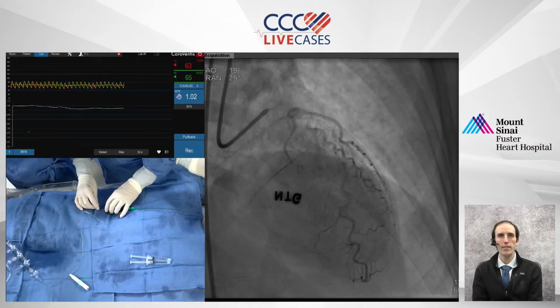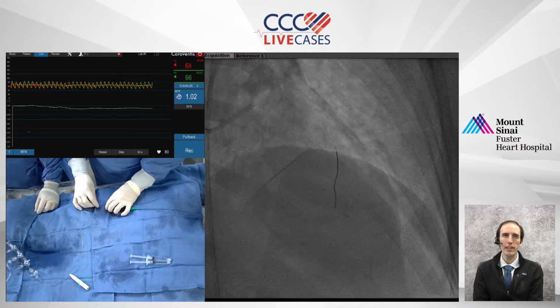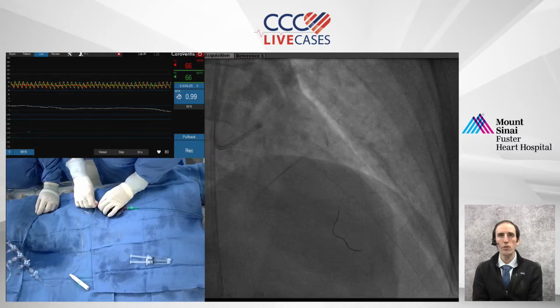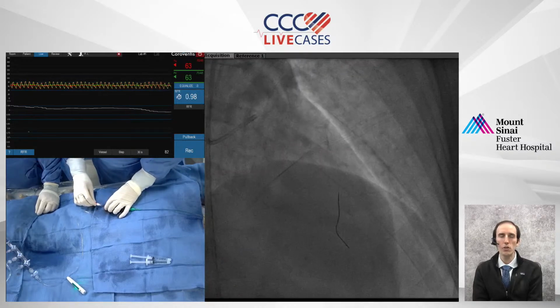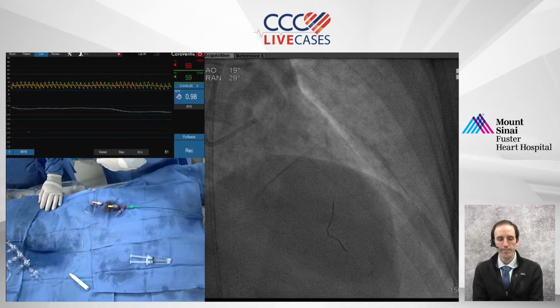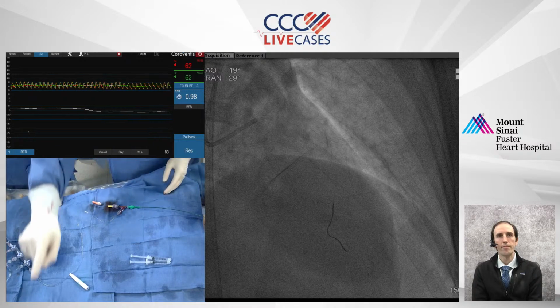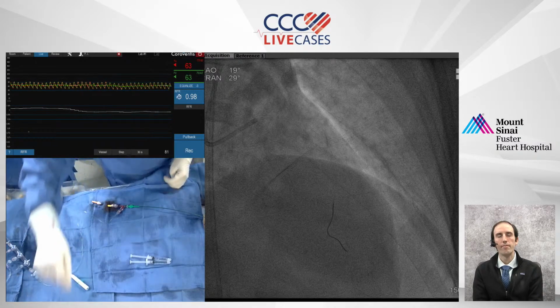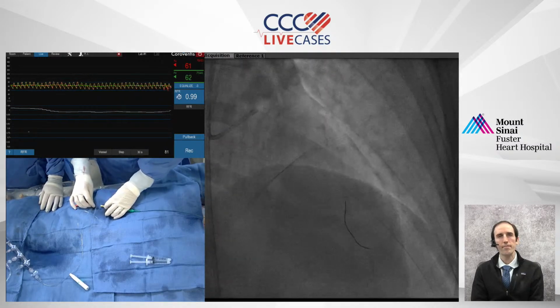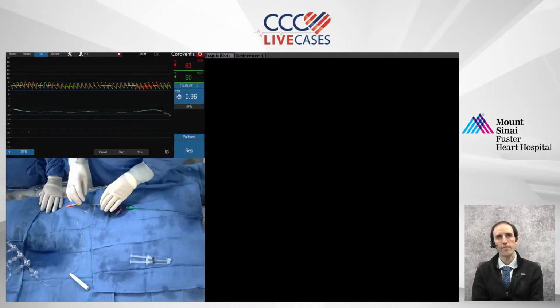Yeah. I do think that it's important, and I'm sure you do this too, that you want to avoid pleating because you don't want to introduce any epicardial narrowing into a vessel that's otherwise healthy. So if it's a really tortuous vessel, sometimes you have to take that into account when you're deciding where to position your wire. Exactly, and that's what I'm doing here. So you see all that tortuosity distal. It's a great point, Nat. So the thermistor is in the proximal part of the black marker that's going to measure the temperature. So I think I'm at least 2/3 of the way down the vessel there, or at least before the tortuosity.